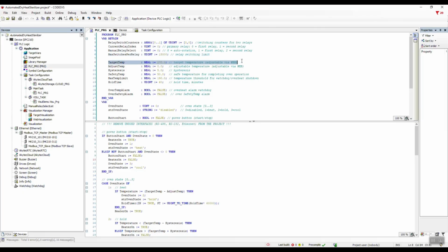Target temperature for disinfection. Hysteresis value. Safe temperature at which instruments can be removed from the sterilizer. Time to maintain the target temperature in minutes.